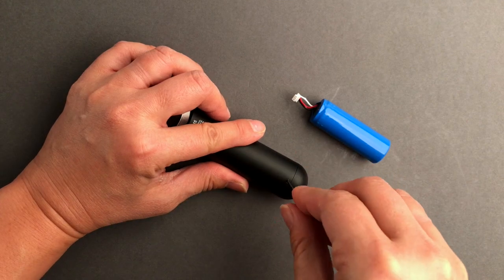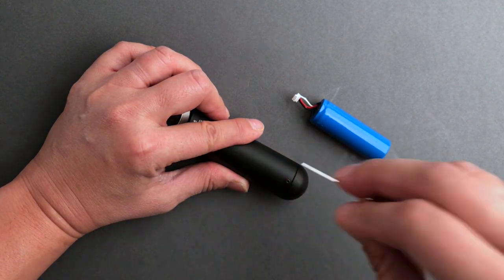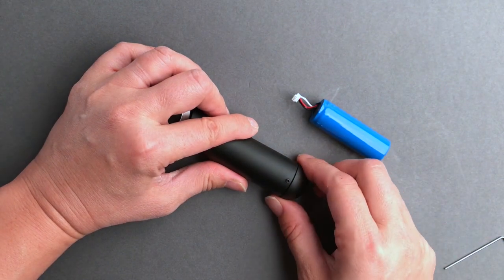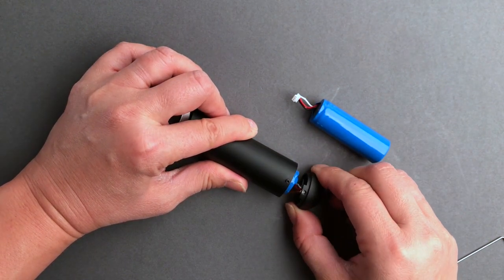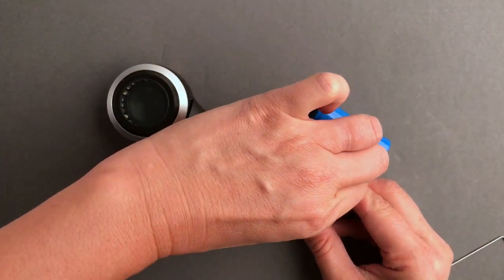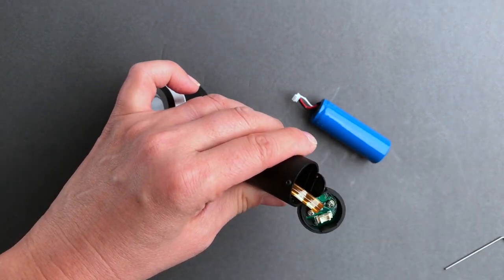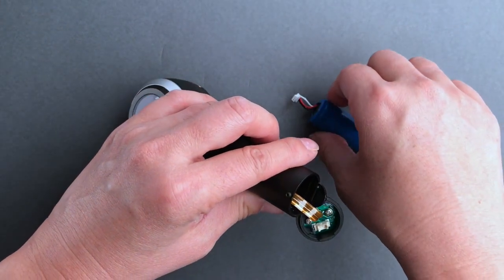Use the Allen key to loosen the set screw that holds the battery cap. It is not necessary to remove the screw completely. Then pull off the battery cap and disconnect the white battery connector. Remove the old battery and dispose of it safely.